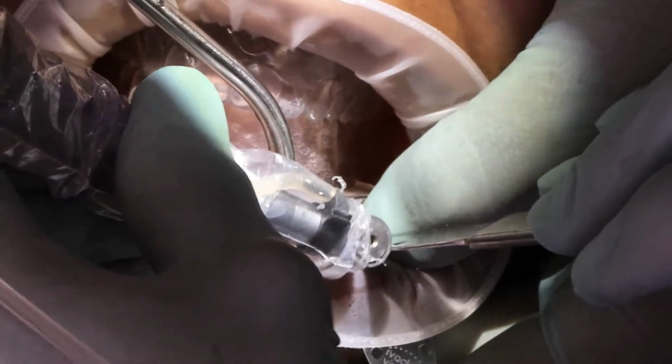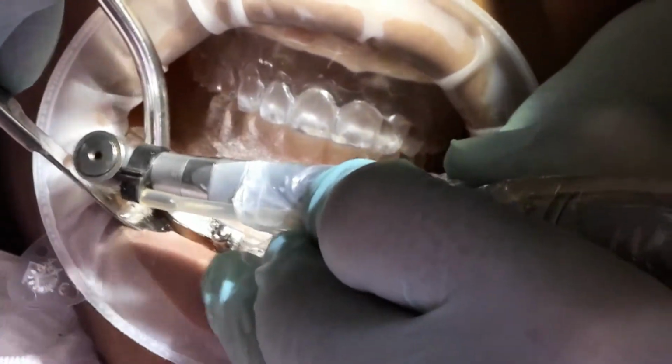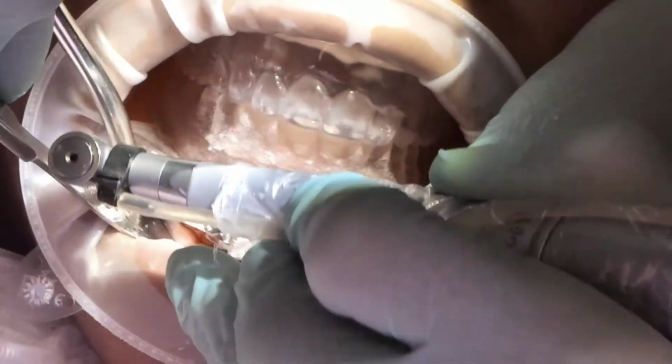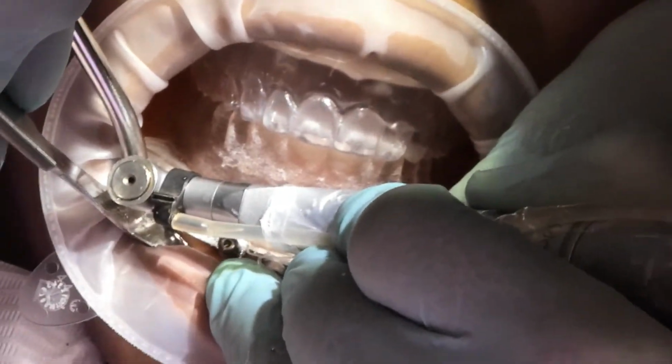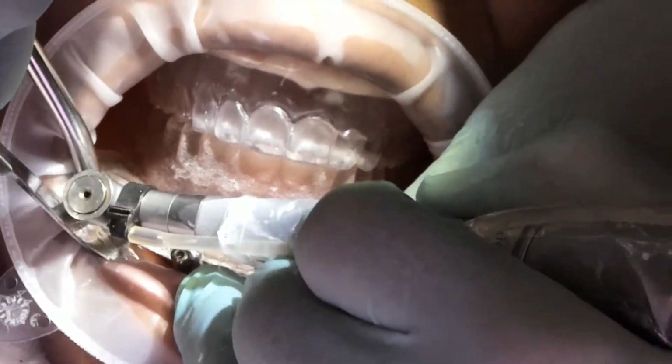With all the sites drilled and the pins seated, remove the mandibular pins, remove the fixation base and the pin guide, and the mandibular now is on hold until the maxilla is finished. In the maxilla, remove all the pins and the fixation base as well and prepare to lay the flap.